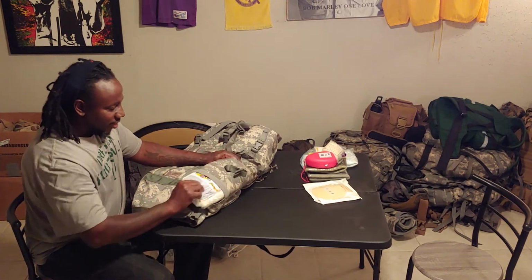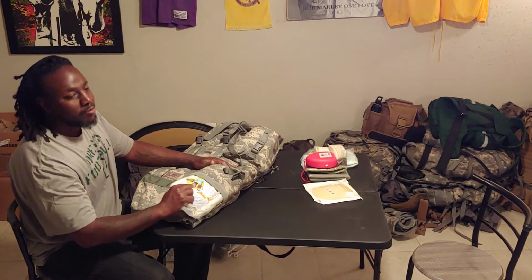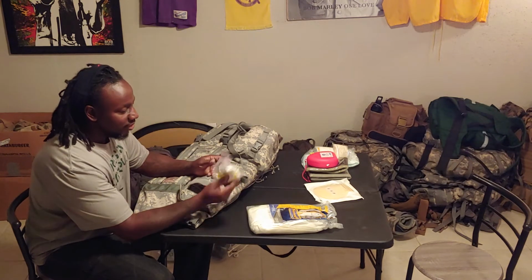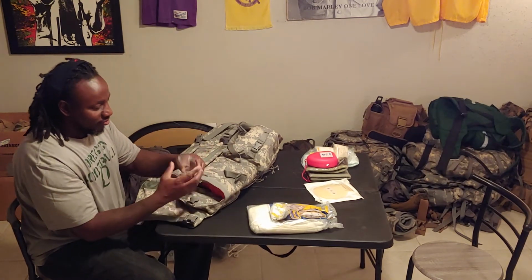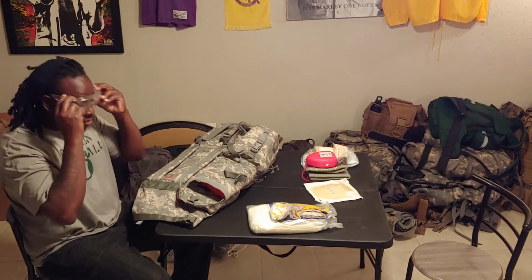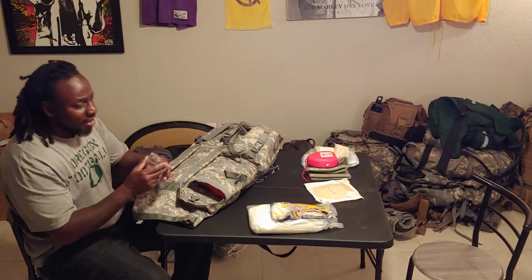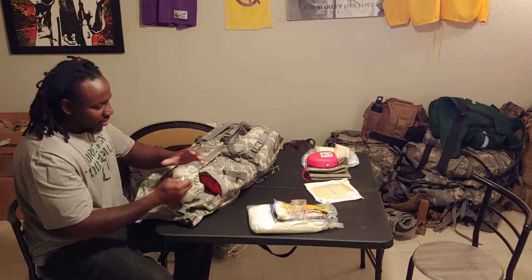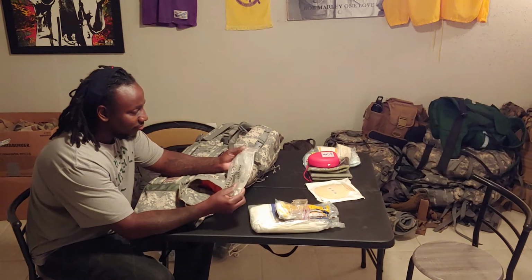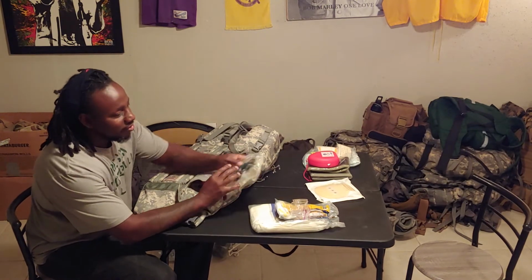Okay. I want to say this pouch is for keeping myself clean, which means blood free on my clothing. It's a paint suit, a little respirator mask, safety goggles, which I need to have wrapped up in something because they are scratched up. Golly. But hey, it's better than nothing. I need to go and get another pair of these and put a safety sock around those. Man, I've had this pair of goggles for I don't know how long. Golly, yeah. They're still fresh in the package. They probably need to be replaced too.